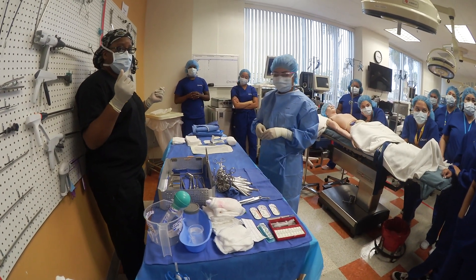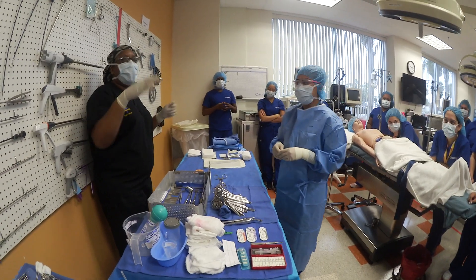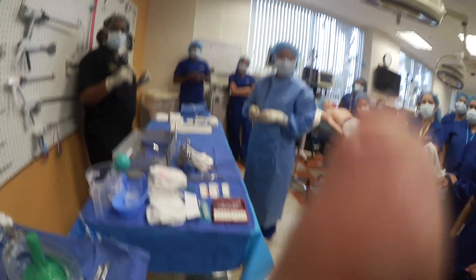Number five: select suture reel — crossed out. End of assessment.